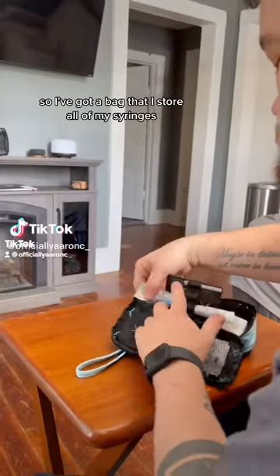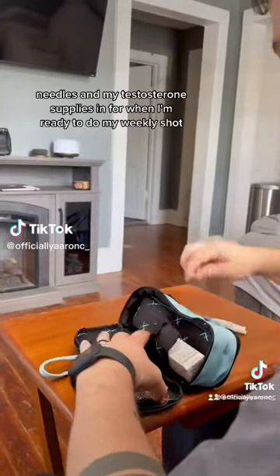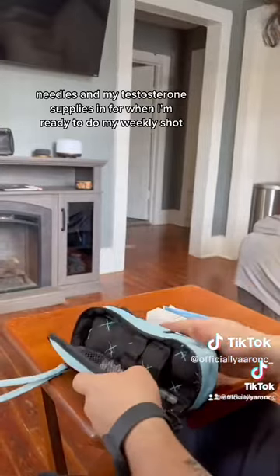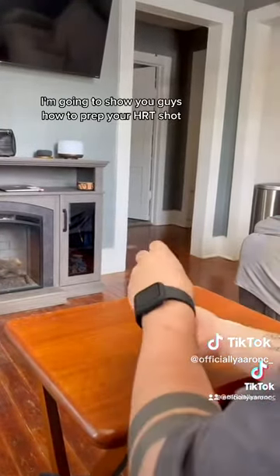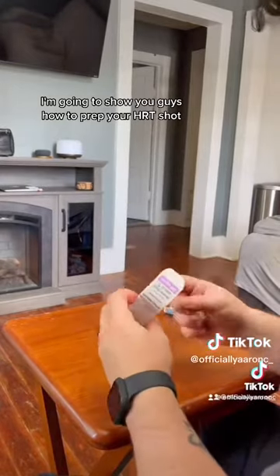I've got a bag that I store all of my syringes, needles, and my testosterone supplies in for when I'm ready to do my weekly shot. I'm going to go ahead and show you guys how to prep your HRT shot.